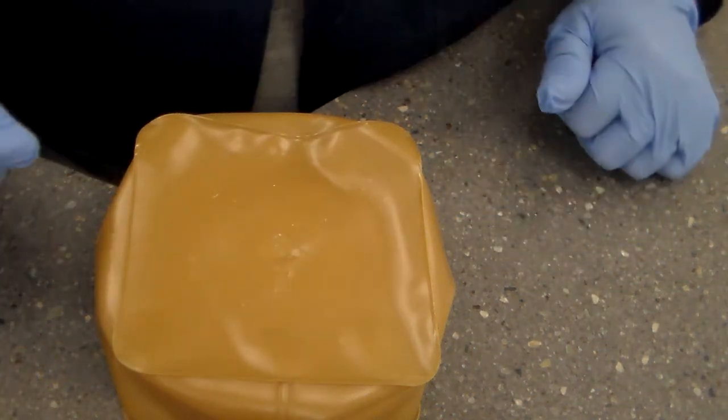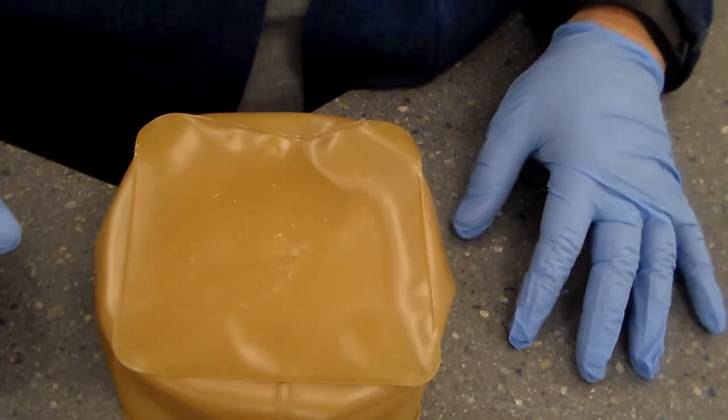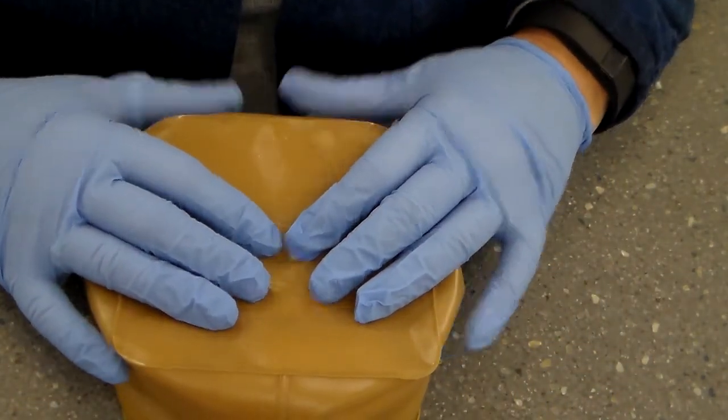Hi, this is skill 2.40, administering intramuscular injections. Now for this skill, I'm going to jump right to the actual injection of the medication.